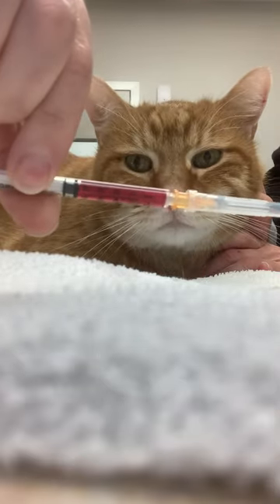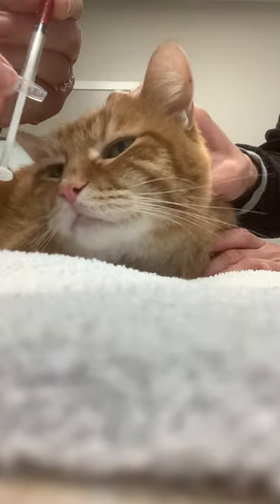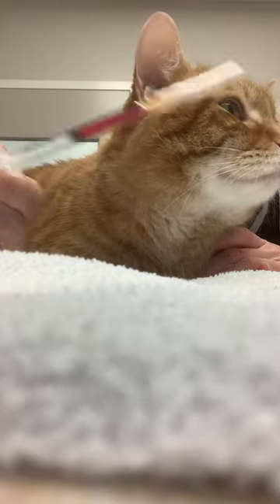The B12 will come in a syringe like this. There will be a piece of tape at the end on the plunger just to help prevent it from coming out while it's being transported, so you'll just remove the tape when you get home.